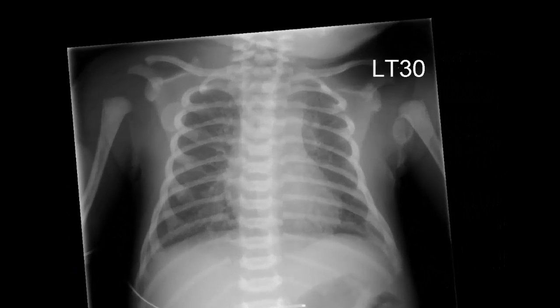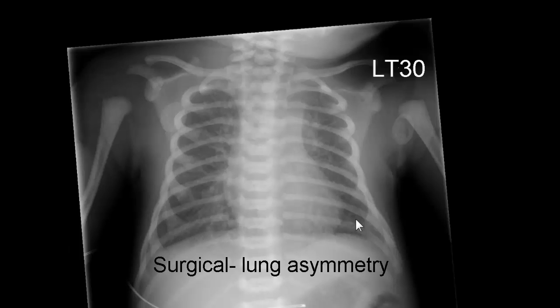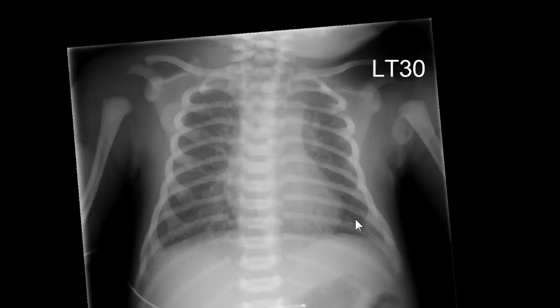When I started off talking about differentiating medical from surgical diseases, the main aspect of any medical disorder — whether pulmonary or cardiac — is that the lungs tend to be involved in a symmetrical fashion. When we get to surgical disorders, there'll be asymmetry of aeration of the two lungs, often with mediastinal shift, although not necessarily.